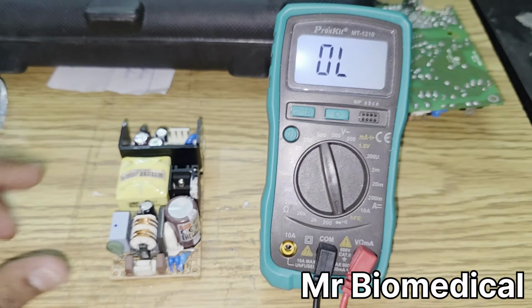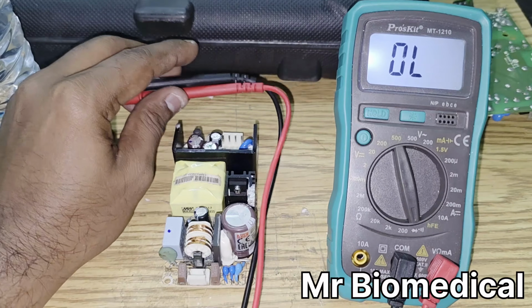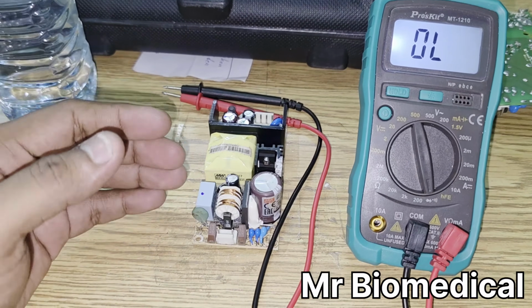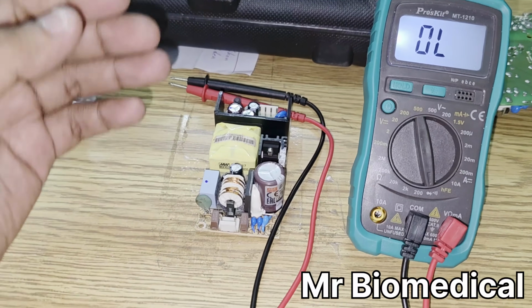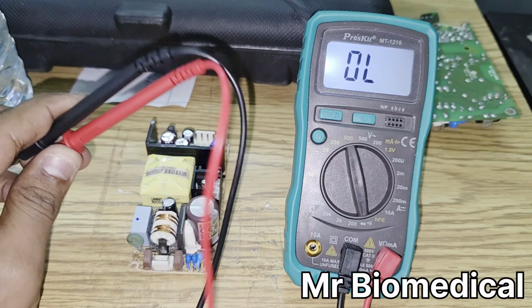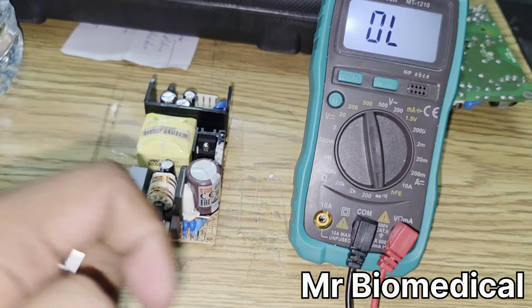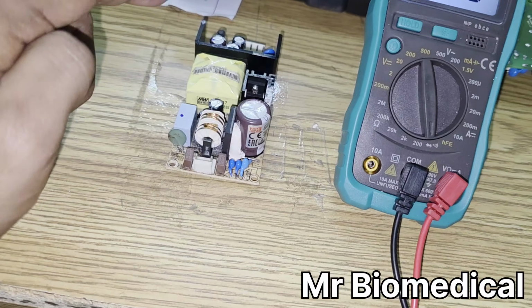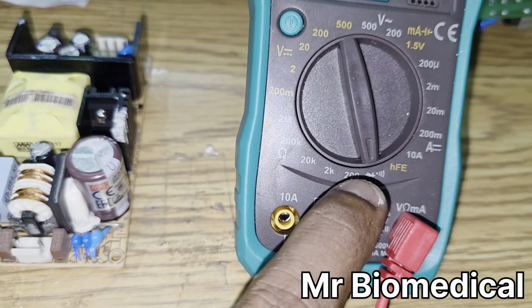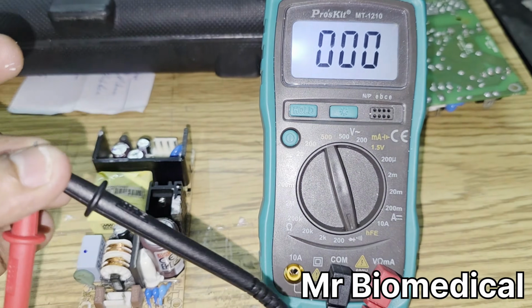So here is a multimeter. As a biomedical engineer, we have to know how to use a multimeter clearly, whenever you are going to attend some complaint regarding the power supply or socket or wire or whatever it may be. The multimeter is the most important thing. Remember, how to use it is the key. In board repairing, everything can be solved with only one mode, which is diode mode. This is the diode and continuity mode. As you can see, if I connect the probe like this, it will give you the buzzer sound.